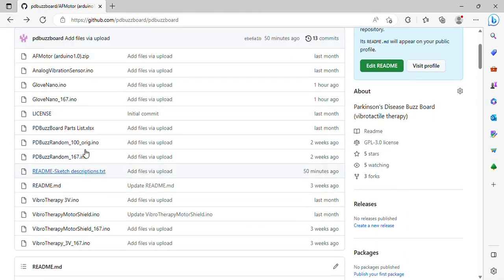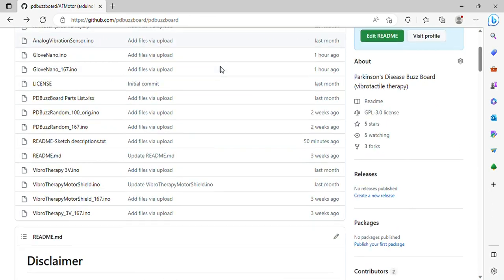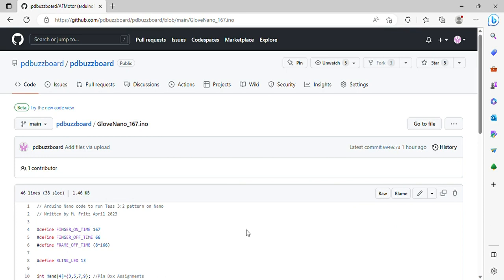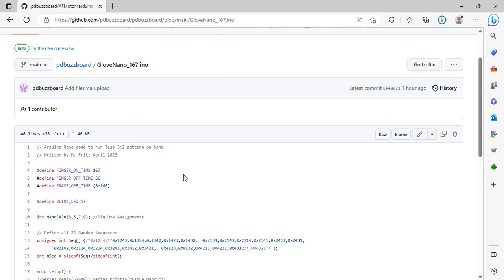A little bit of improvement there. We now have a Glove Nano and a Glove Nano 167. I actually haven't run these, but they are a random pattern if that's what you want to work with. I think the one thing we can all agree on with Parkinson's is it's a very personal disease — what works for one may not work for another. Try something different. If I go into a sketch, you'll see it shows me the sketch. On the raw button, if I right-click and save link as, it will download the sketch as a .ino. Then all I have to do is open it and off I go. That's how you can get a sketch out of GitHub easily.